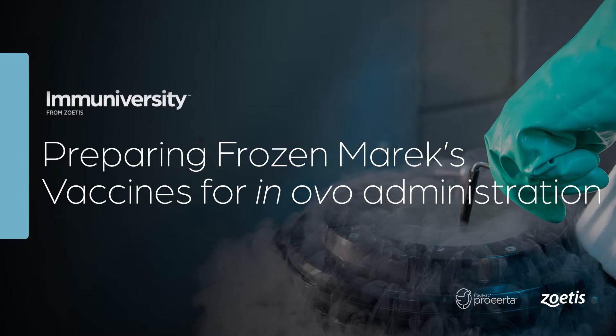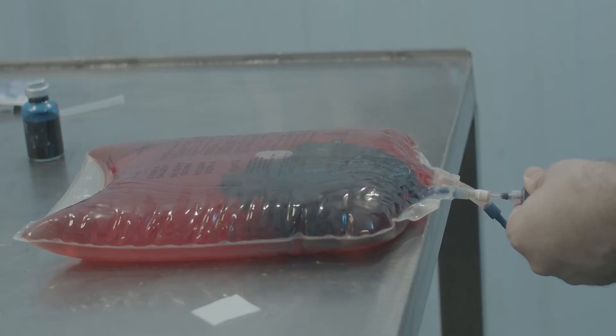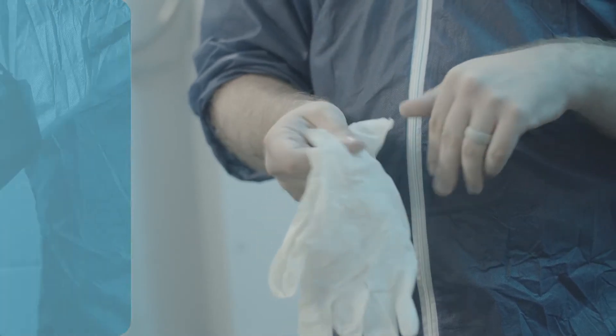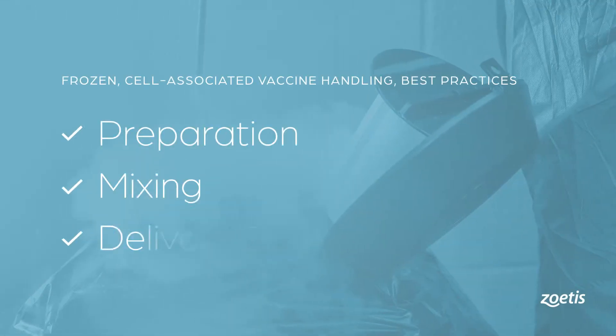Frozen vaccines, specifically cell-associated vaccines, require special care. For optimal results, we will walk through important steps in the preparation, mixing, and delivery of frozen Marek's disease vaccines, commonly used for Innovoject injection.